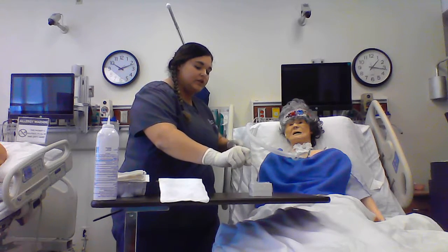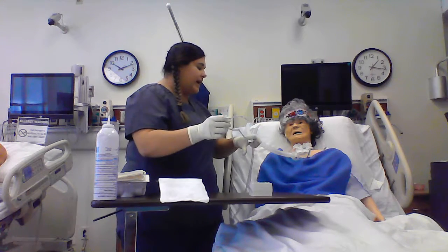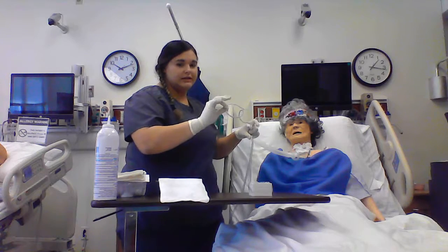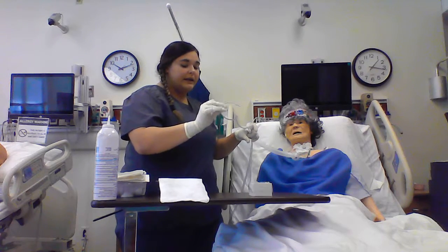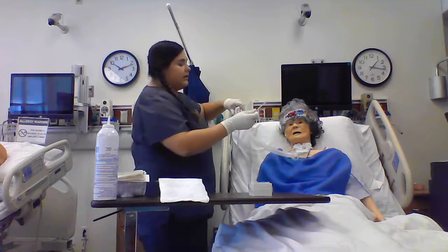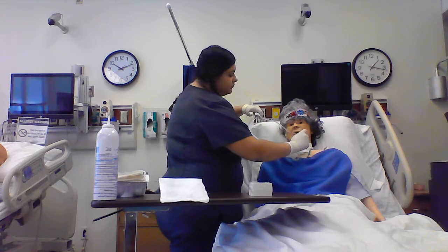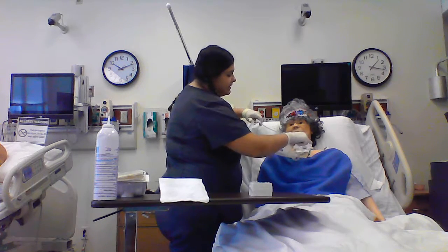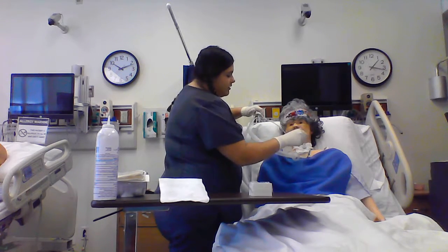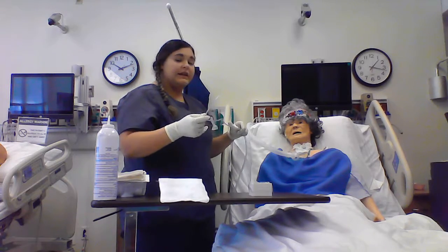I'm going to clear my tubing. If my patient was in obvious distress, or if they needed a break, I could hyperoxygenate them again, making sure not to contaminate my dominant hand or my more sterile hand. At this point, Ms. Opal's okay. So we're going to suction one more time. Going down until I meet resistance here. And then on the way out, intermittently suctioning. Great job. So I can tell that she is breathing a lot better here.